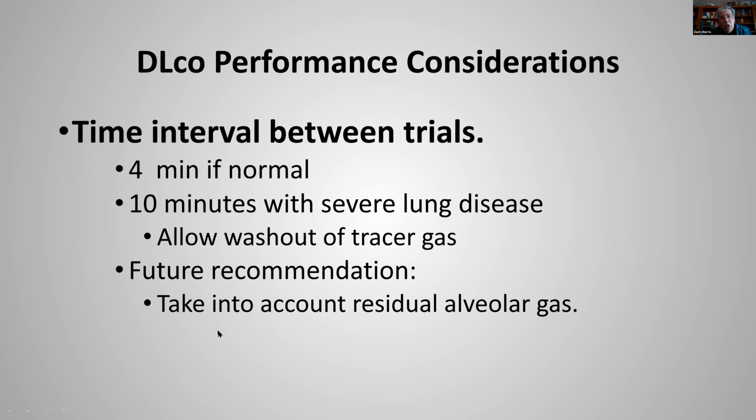Future recommendations are going to take into account the residual alveolar gas. In other words, whatever gas is left over, you're breathing in. The recommendations are that you should do some back calculations. You don't have to wait that 10 minutes, and it'll take into account that tracer gas effect and subtract it out. But as of now, I don't think any of the systems actually do that, though it is now a recommendation. I know they're working on it.